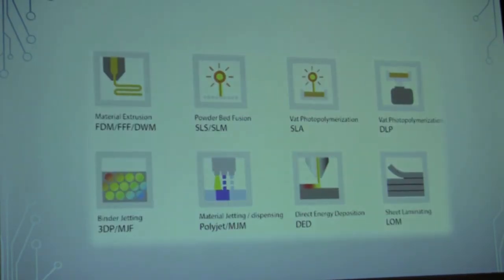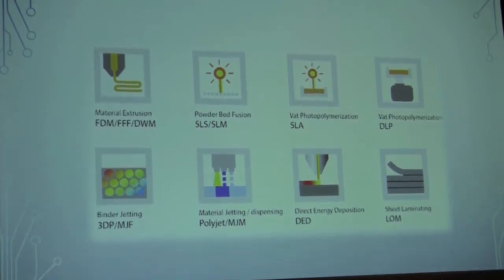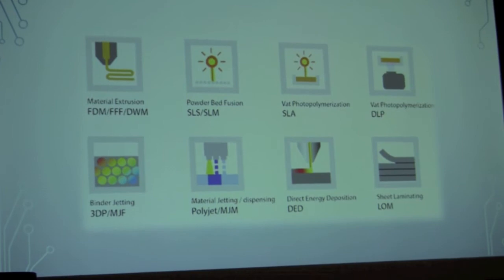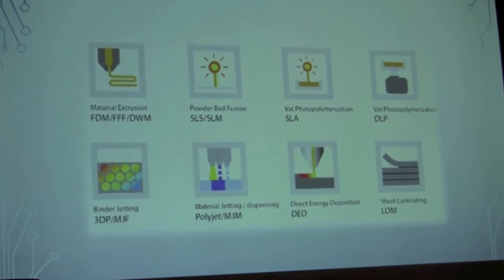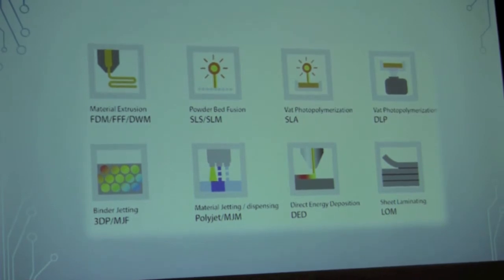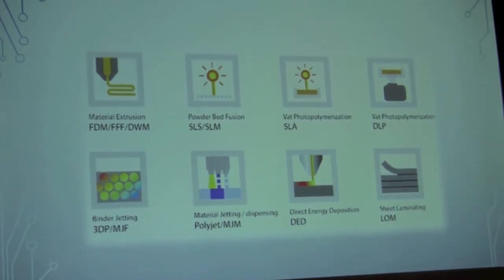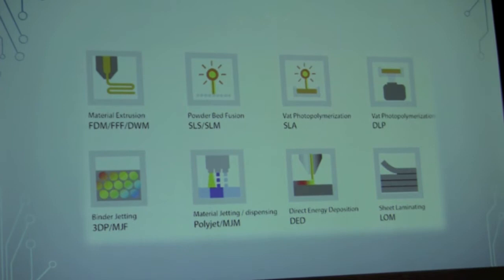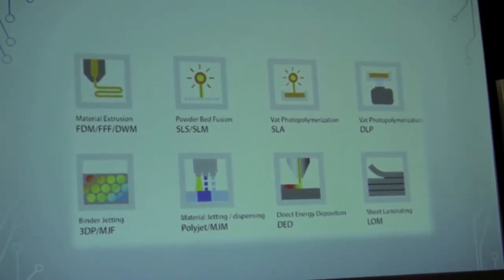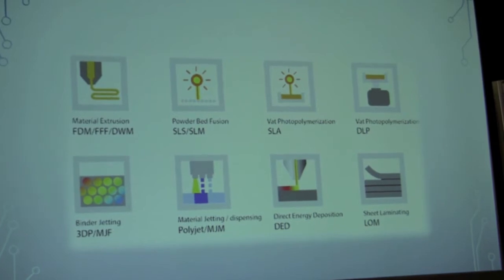So for those systems, there's multiple types of 3D printing that we see on the market today. We have fused deposition modeling, we have SLS, SLM, the stereolithography, or photopolymerization, which is what we're going to focus on today. That's the most popular. I'm going to probably guess that that's what everybody here has, a photopolymer printer. Is that correct? The people that did raise their hand.